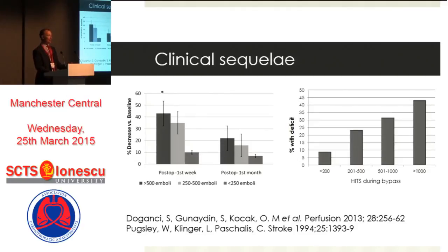Now, over 20 years, and one of these papers is from 20 years ago and one is from 1 year ago, cardiac surgeons and anaesthetist perfusionists have attempted to correlate the incidence of GME with neurocognitive outcomes. There are two things to say before we're too critical of this literature: the methods available to detect GME have constantly changed and certainly were not very sophisticated 20 years ago.